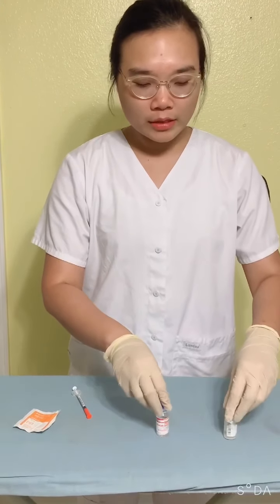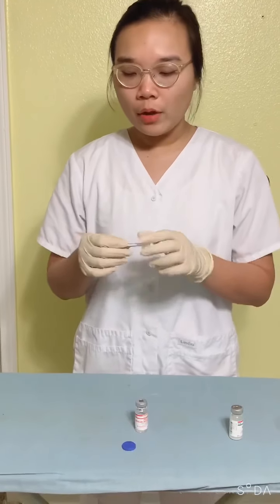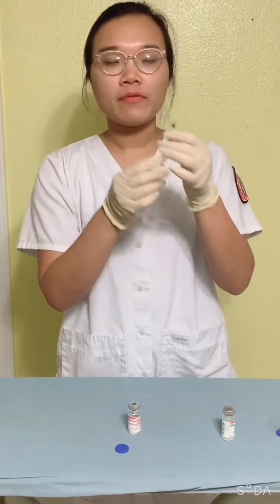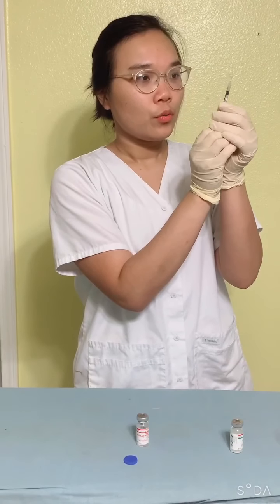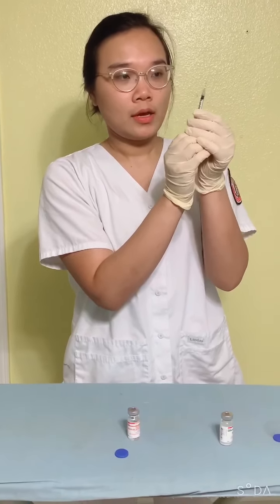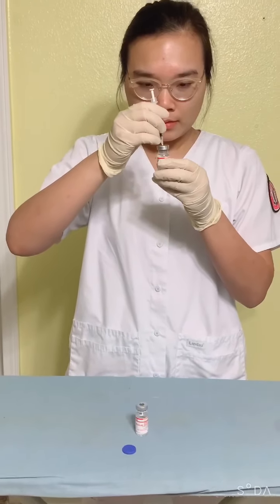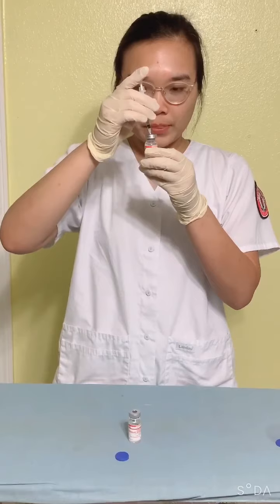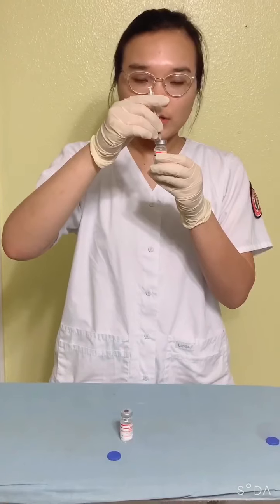Next, I would clean the top for both the vials. Now, I am going to aspirate the volume of air equivalent to the first dose of the first medication, which is NPH. And then I would inject it into the first medication, making sure it doesn't touch the solution.